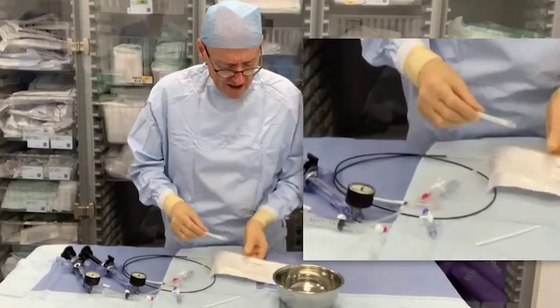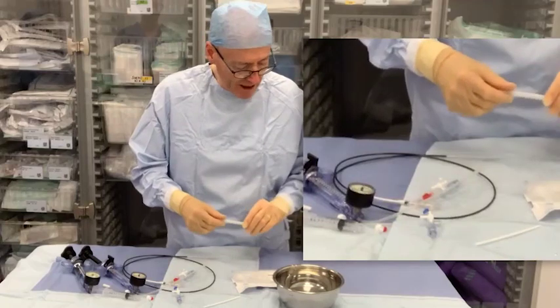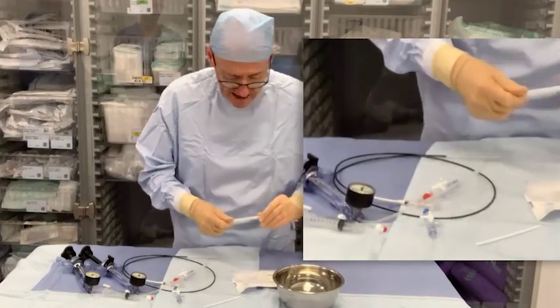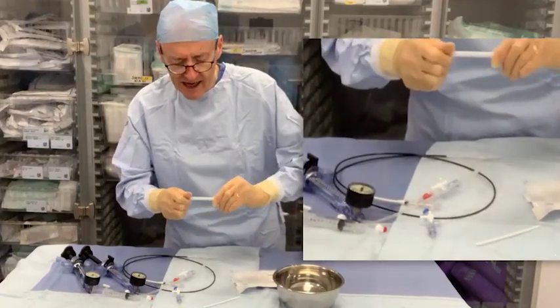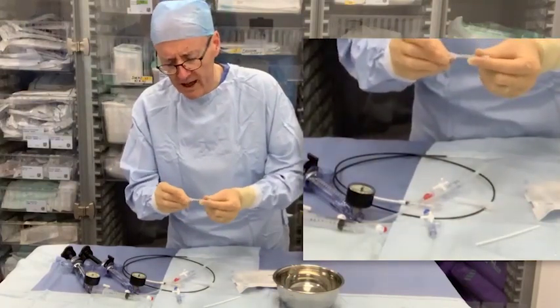This is the Optimus stent L — large, rather than extra large — 43 millimeters long. It's a cobalt chromium stent and it comes in this setup on a sort of hollow tube.